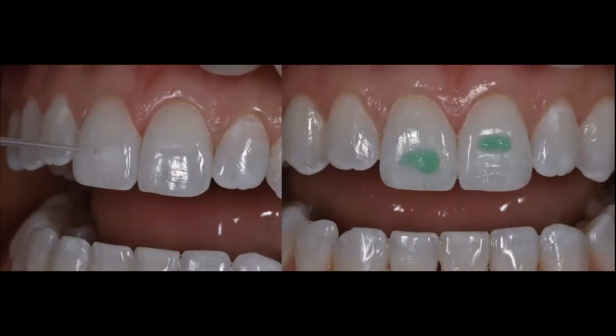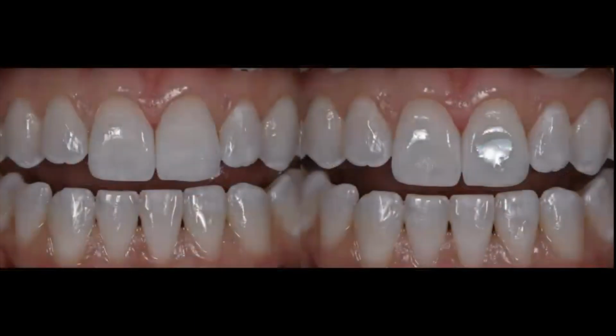Again, this is a lot easier said than done when you're doing it clinically. The teeth are dehydrated. It's kind of hard to tell, but you really want to be using magnification. You want to make sure that you're looking at this, that you're drying well. That's why you have the Icon Dry, so that it absorbs within the enamel, and you dry as best as possible. And the idea is to obtain what you see on the left-hand photo.